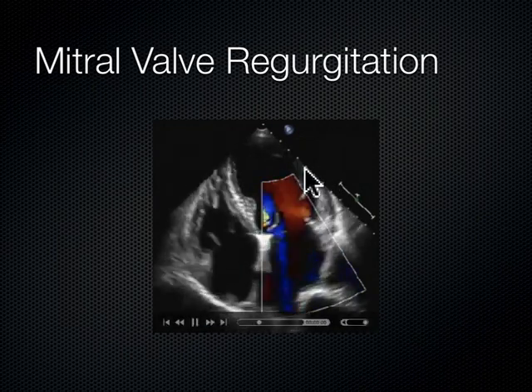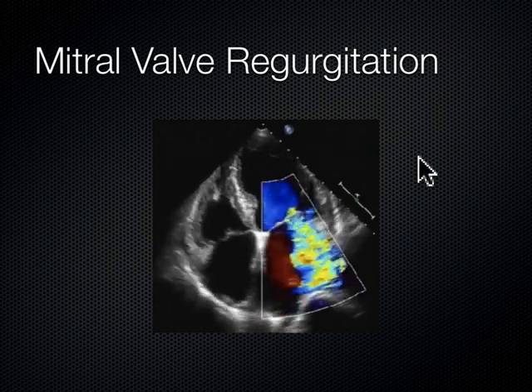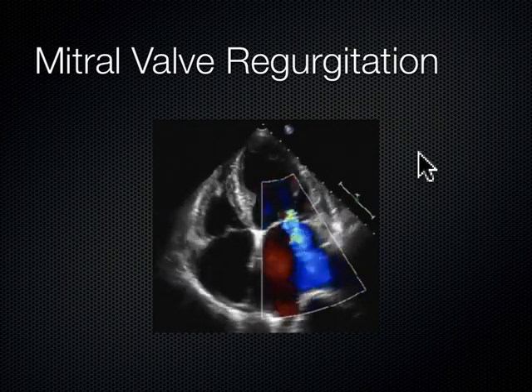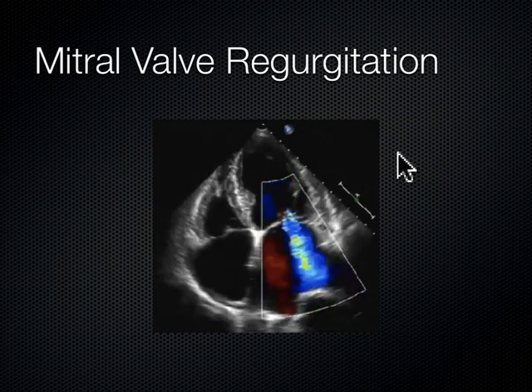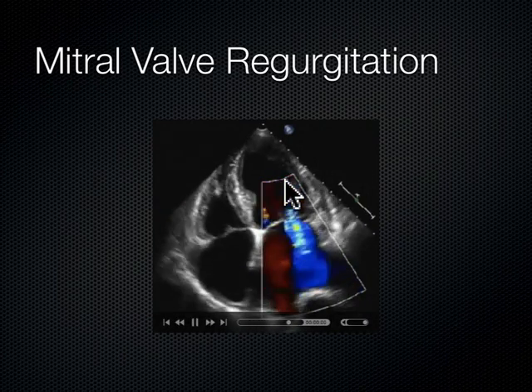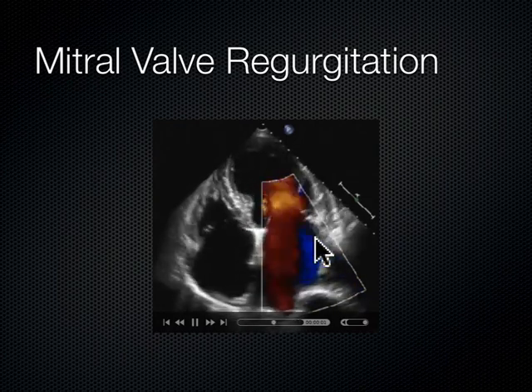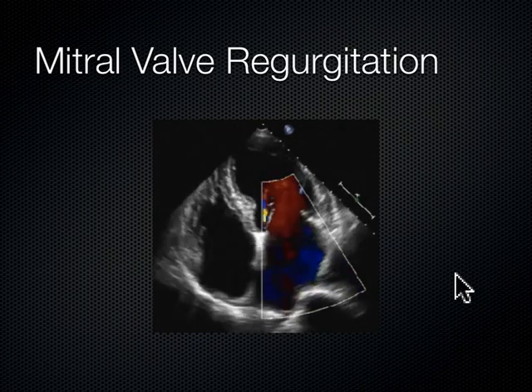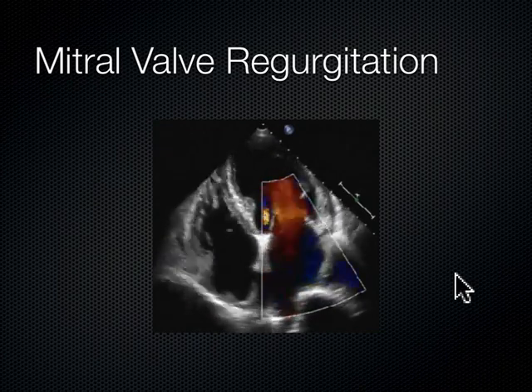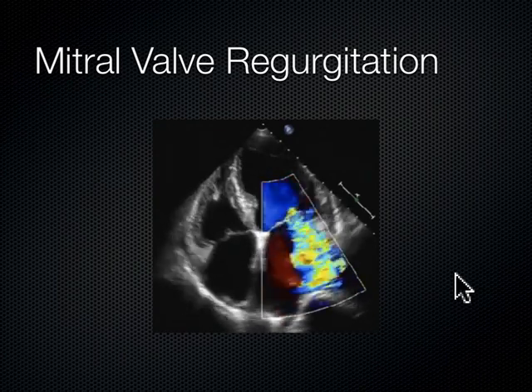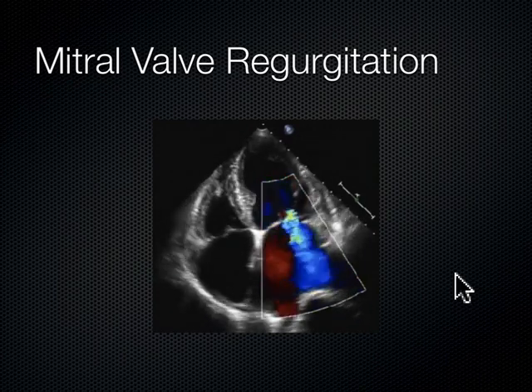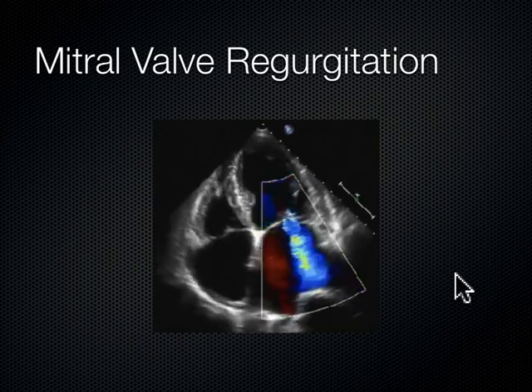During systole — BART: blue away, red towards. We don't expect to see blood squirting away from the probe back into the left atrium. So this blue jet that we see here coming into the back of the left atrium and smacking into the far wall — that would be somewhere around moderate to severe mitral valve regurgitation, because during systole we shouldn't see that blue jet slamming back into that left atrium.